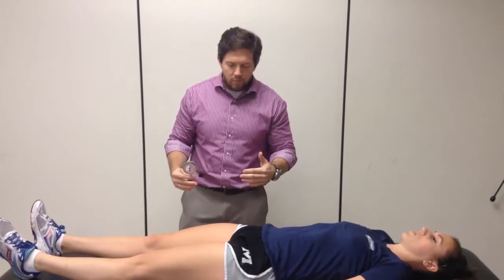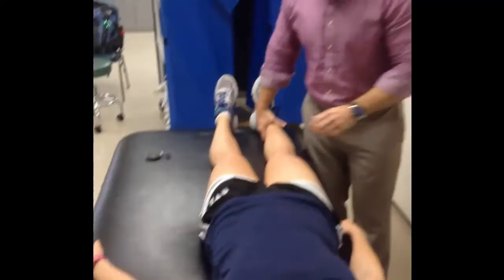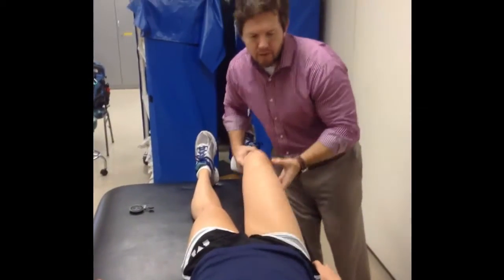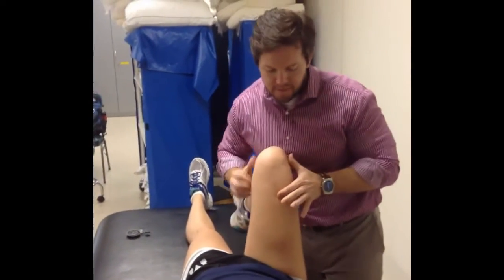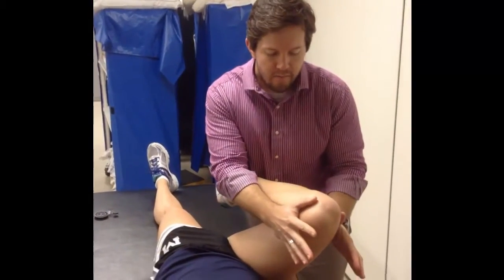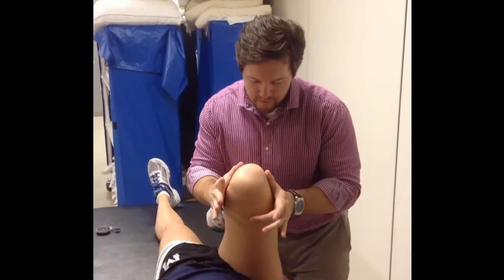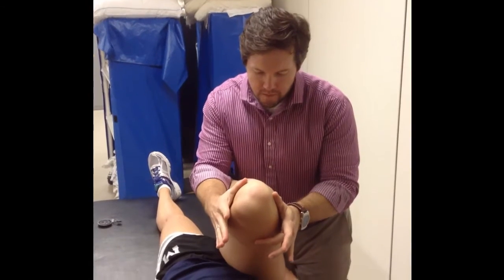Because it's not a straight-line joint, there is going to be some cheating that the body will try to do based off the arthrokinematics. So as I take that inclinometer and bring her leg up into a flexed position, the natural tendency is for it to get to a certain point and then roll out. As it rolls into that abducted position, I start to lose reliability for this measure because I don't know how to measure both hip flexion and abduction at the same time. So you really need to make sure that you only go up to the point where you just start to feel that leg want to swing out into abduction.